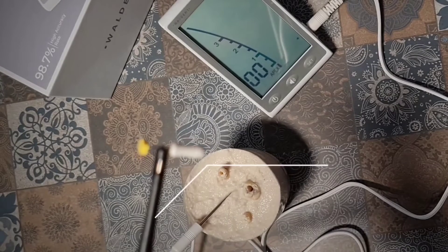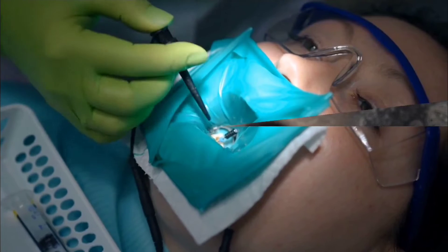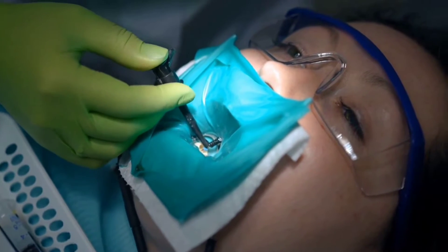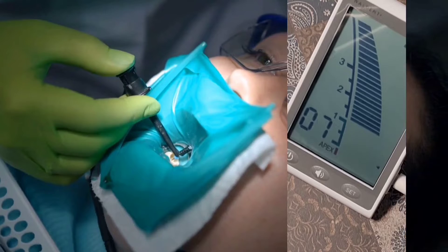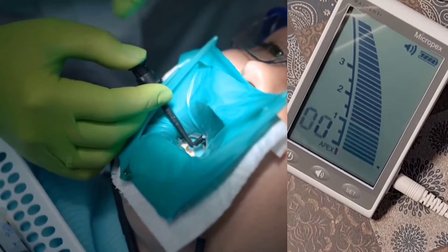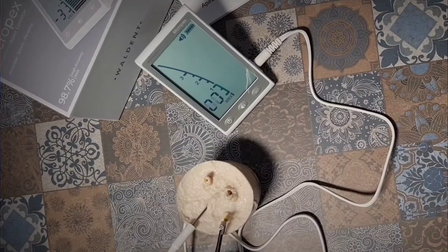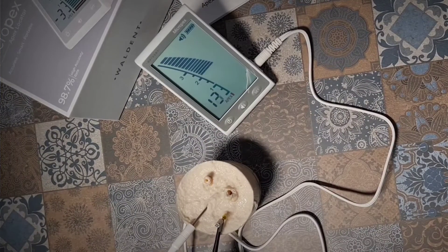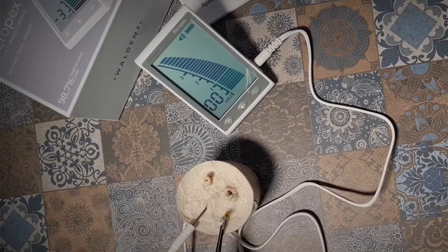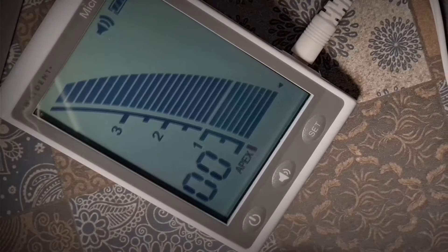Clip a K file or any file to the file clamp, then slowly move the file in an apical direction. As you get closer to the apex, the beep grows faster, and when it reaches the apex, the sound becomes continuous. As you get closer, the beep grows faster, and when it reaches the apex, you get a zero reading.